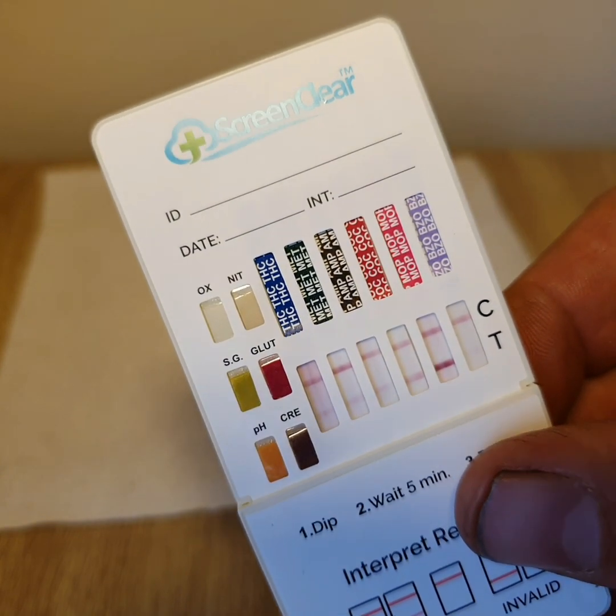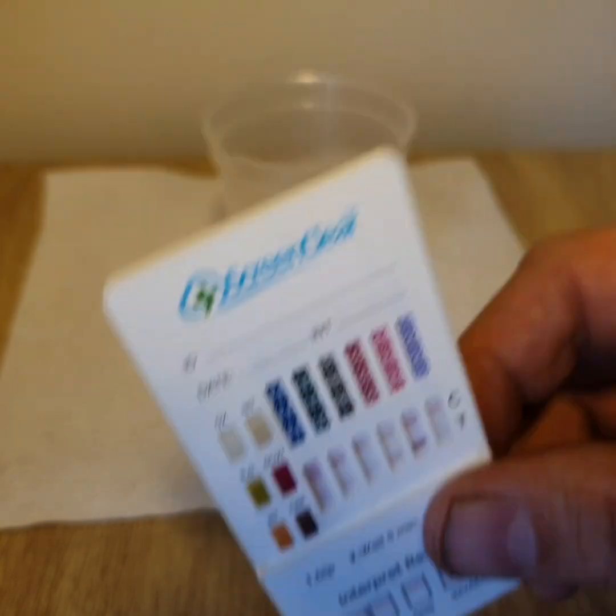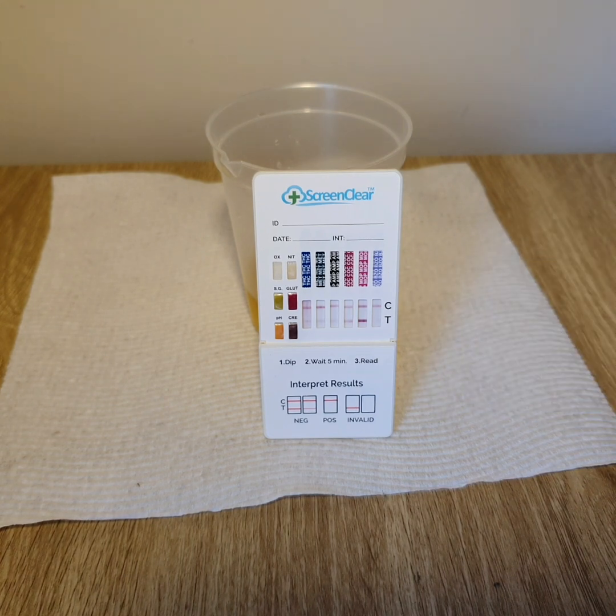So what we're looking for here is a line in the C region, which is the top line. This shows that the drug test is working correctly. We're also looking for a line in the T region, which signifies a negative result. This test looks like it's a negative result for all drugs, except for benzodiazepines, which is a fairly faint result at the moment. So we'll have to wait until the line appears. If it doesn't appear by five minutes, we'll have to assume that it's a non-negative result, and lab confirmation would be definitely recommended.